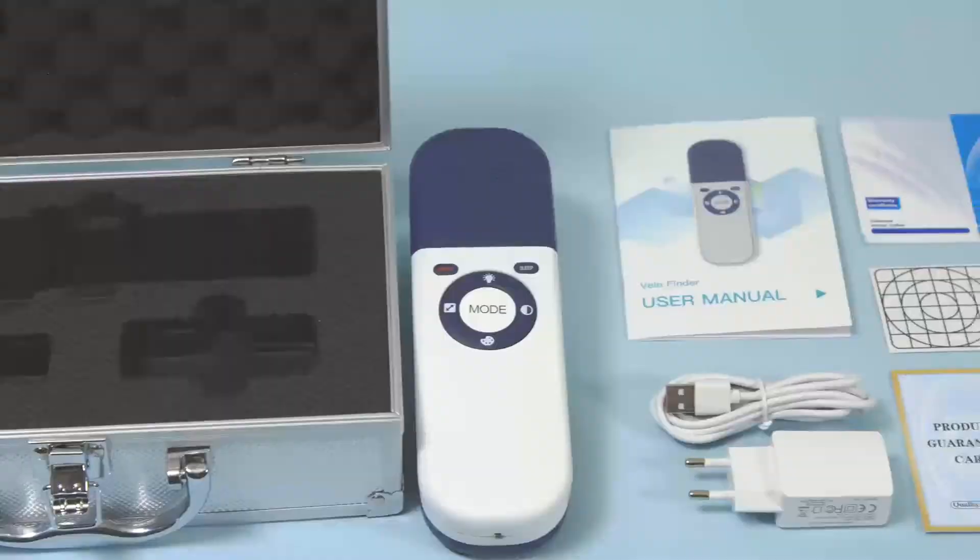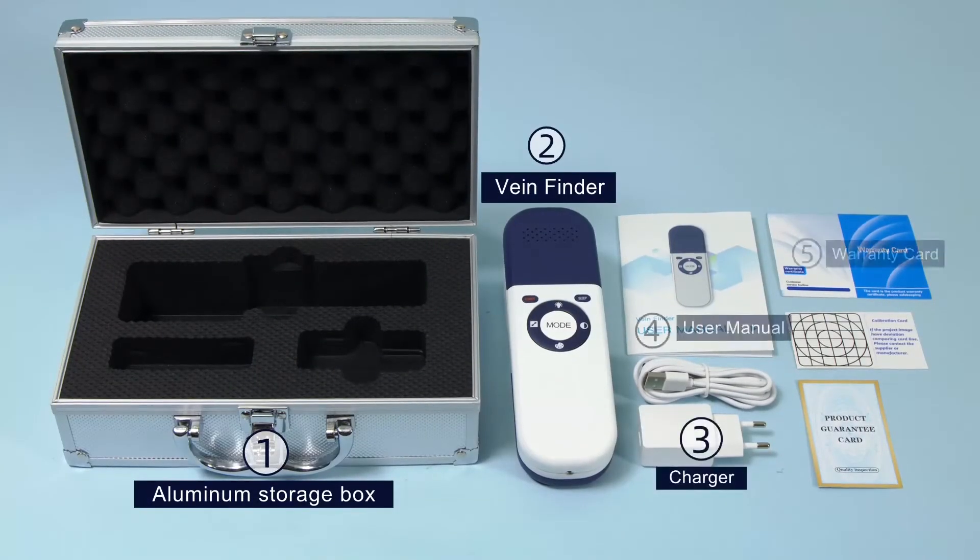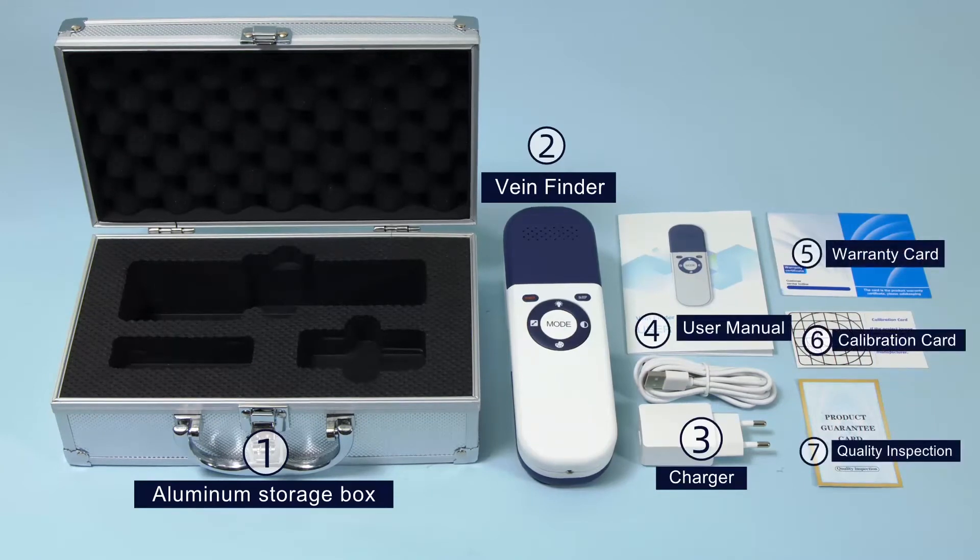The standard configuration of the product consists of an aluminum storage box, VeinFinder, and charger.